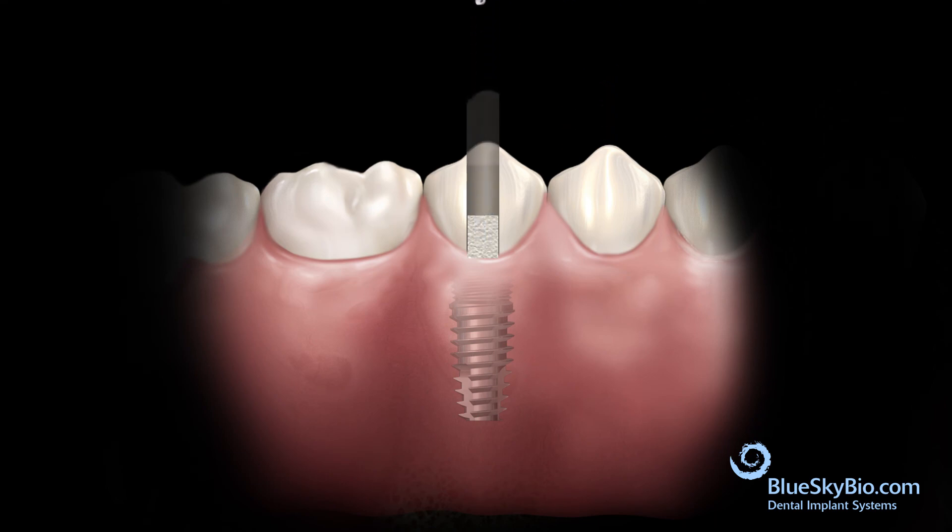Insert a cotton pellet into the screw access hole to protect the screw, then fill the hole with composite.